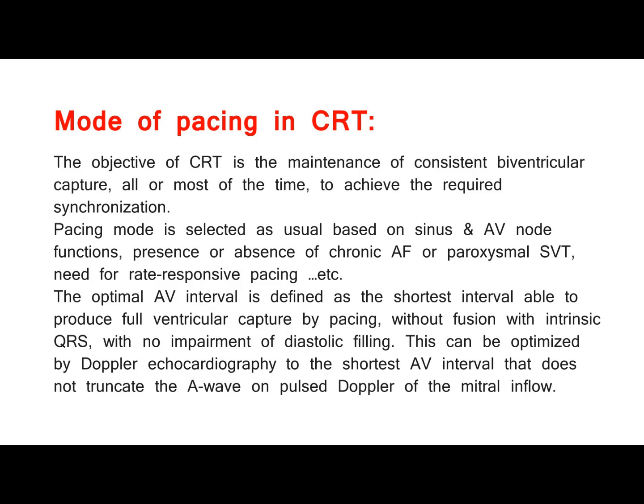required synchronization. Pacing mode is selected as usual based on sinus and AV node functions, presence or absence of chronic AF or paroxysmal SVT, need for rate-responsive pacing, etc.